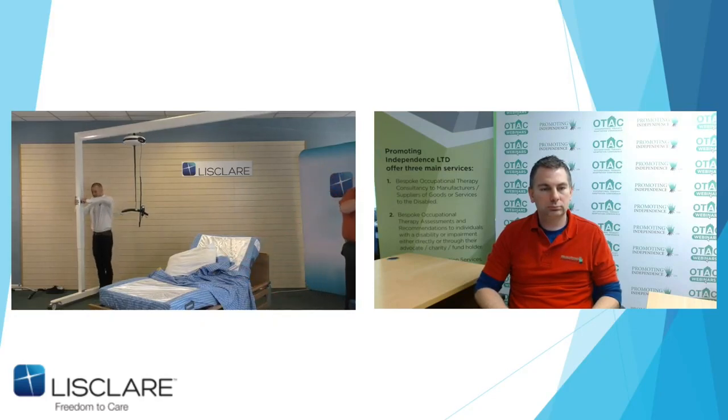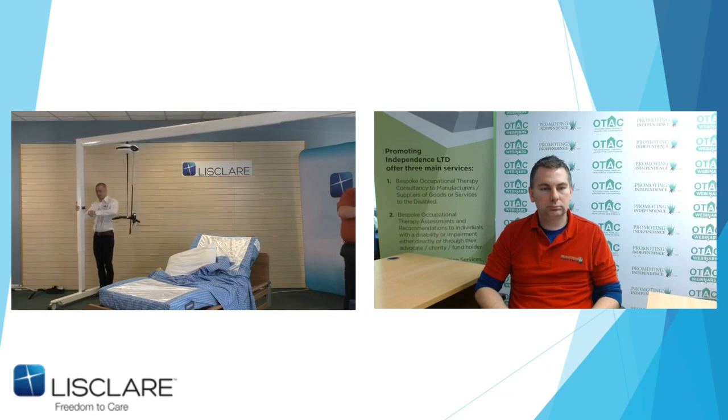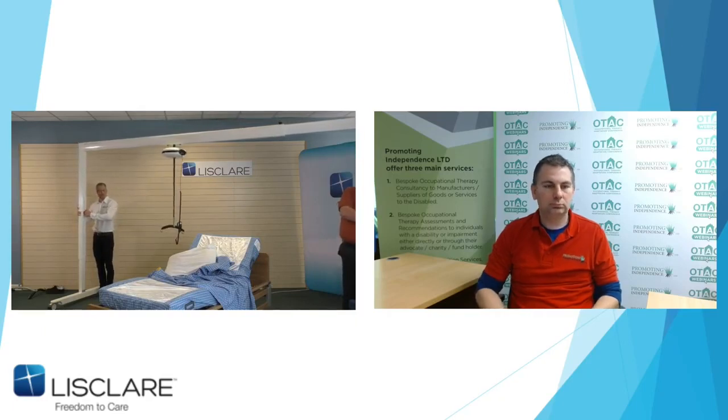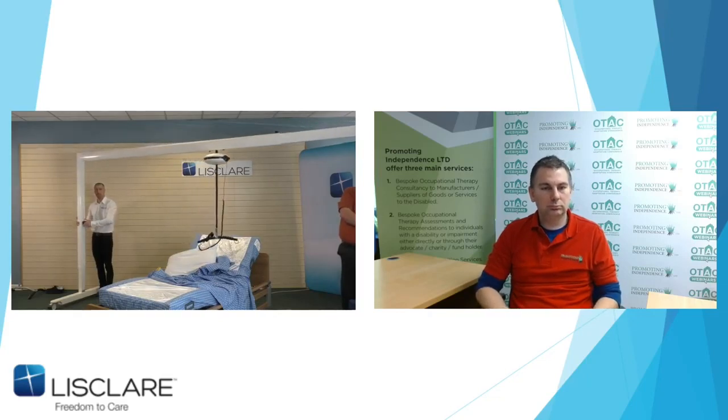If we take it out, we can lock it into various positions, as you can hear. There are about 10 different positions all the way up to all the way down.